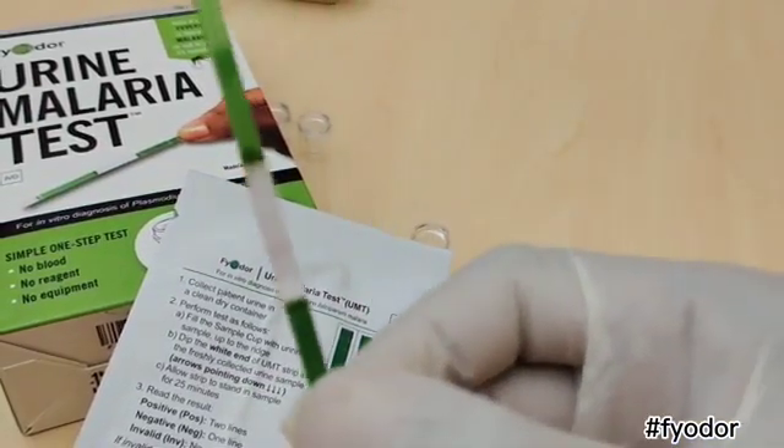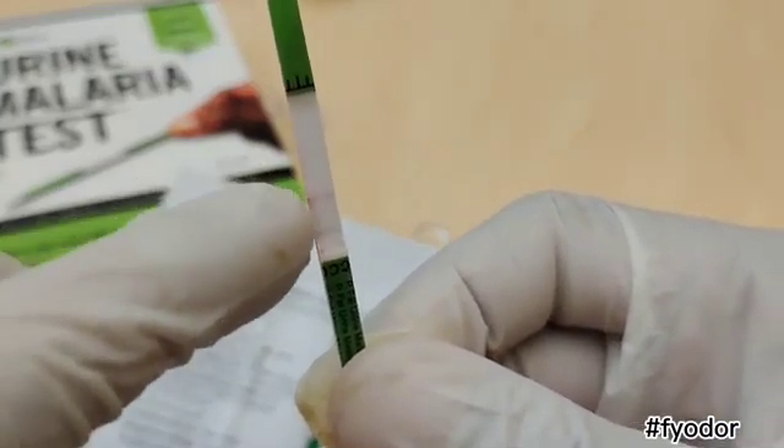If afterwards you notice two lines appear on the strip, it means you are positive for malaria. But if only one line appears, it means you are negative, while if no line appears, it means the test is inconclusive and you have to repeat it with a new test strip.